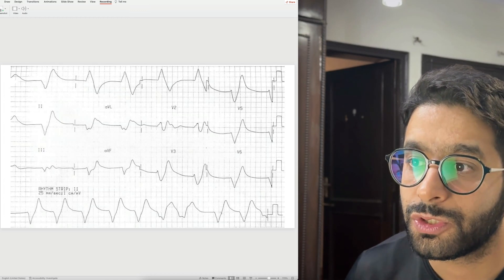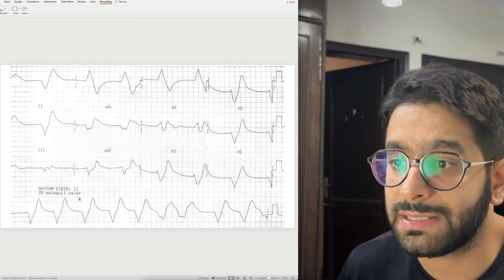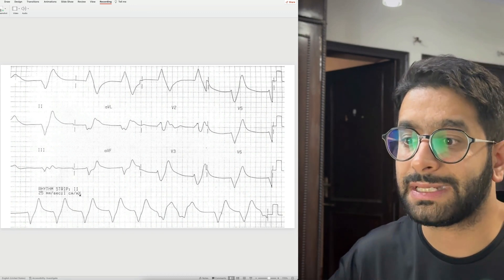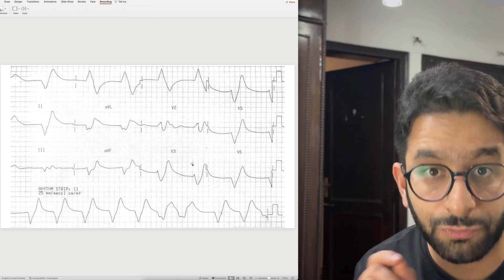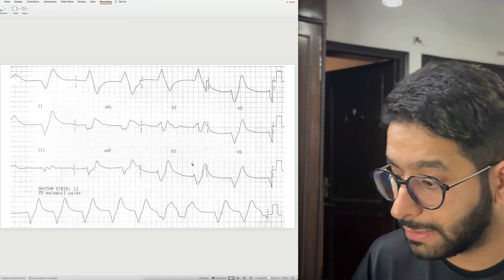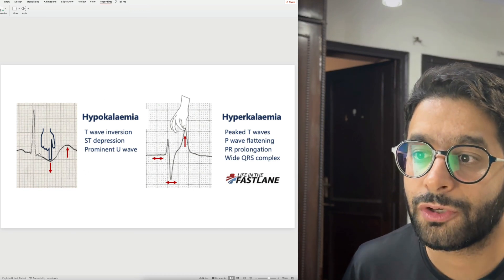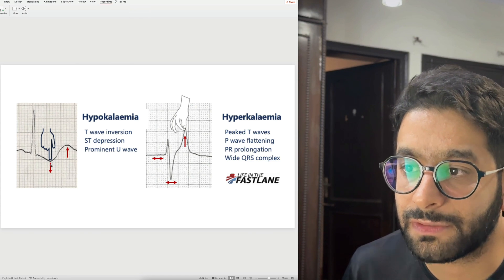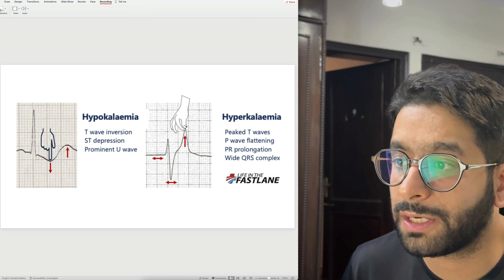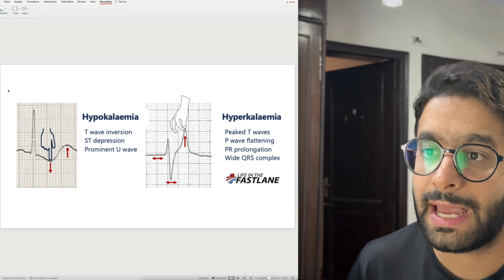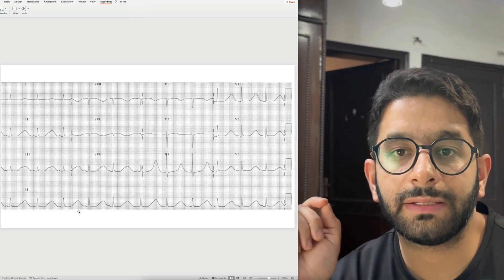The QRS prolongs and prolongs and actually overlaps the T wave and the preceding P wave. The ECG can look very bizarre — a stretched-out ECG with very broad, bizarre-looking QRS complexes. If you see such ECGs, get worried and check potassium. This is a lethal form of ECG. Remember the simple diagram: hypokalemia causes ST segment depressions, T wave inversions, and prominent U waves, while hyperkalemia causes tall and peaked T waves, QRS prolongation, and disappearance of P waves.